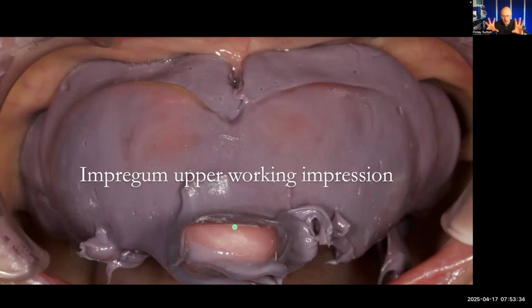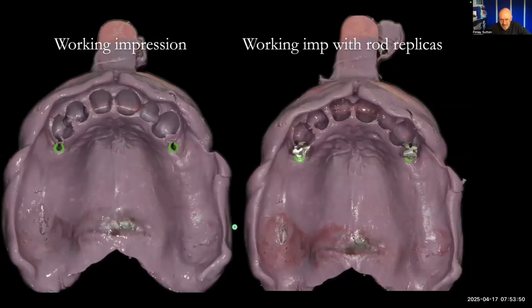So that goes over the impression pickups, and I do my border moulding just like I would do for a complete denture, pulling the cheek, getting the patient to waggle their jaw open wide, and then take that out. So this is it here when I take it out of the mouth, and you can see my impression pickups, rather like doing an implant restoration there.